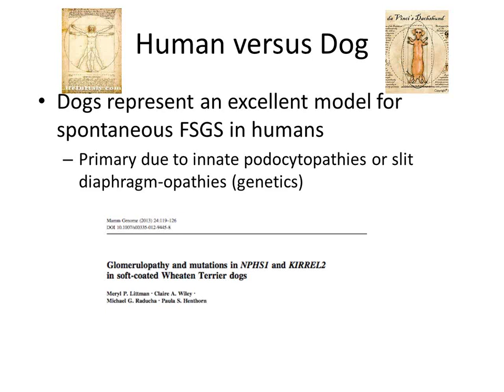And that segmental part of it is really important. I'm not sure why it would be a segmental pattern if every single podocyte has the same mutation, other than the fact that there are probably areas of the glomerulus that have different perfusion pressures or, I guess, filtration pressure. So if it's near the hilus, that's going to have a higher pressure, or if you're near the tip, the urinary pole, that'll have a different pressure. And to me, it's reasonable to think about it that way.